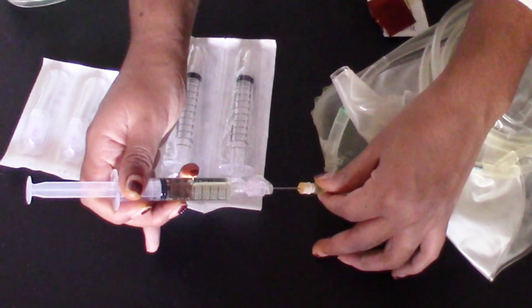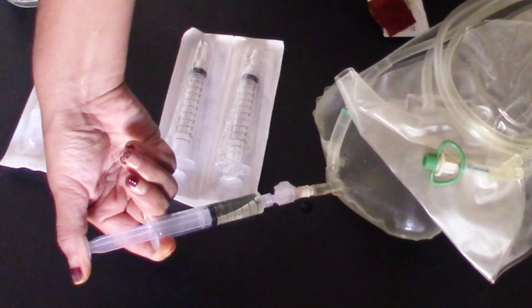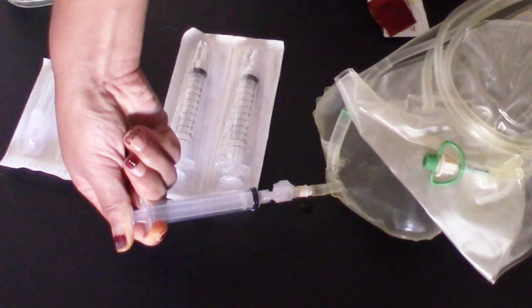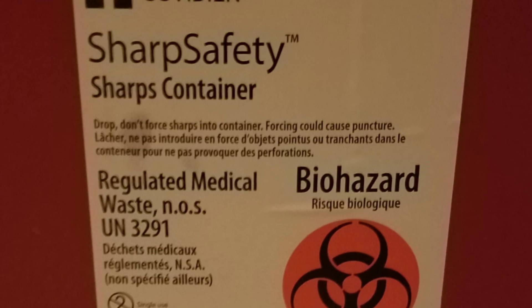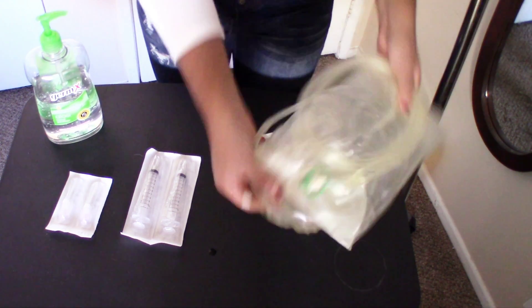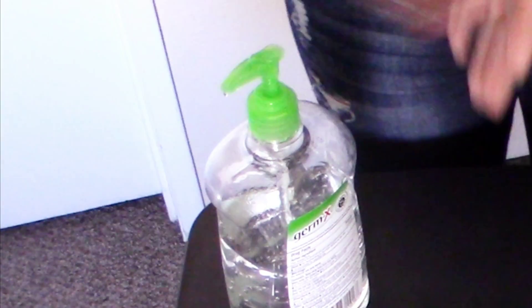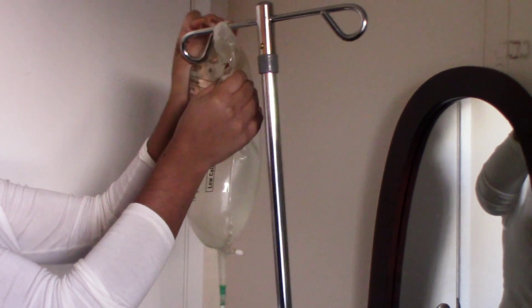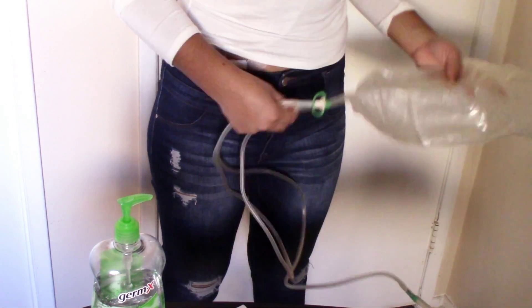Insert the needle back into the medicine port and inject the medication into the solution bag. Make sure you are disposing of your needles properly. Now we're going to move the bag around to evenly distribute the medicine. And that's how you put medication in your manual bag — from here, continue your regular dialysis treatment.